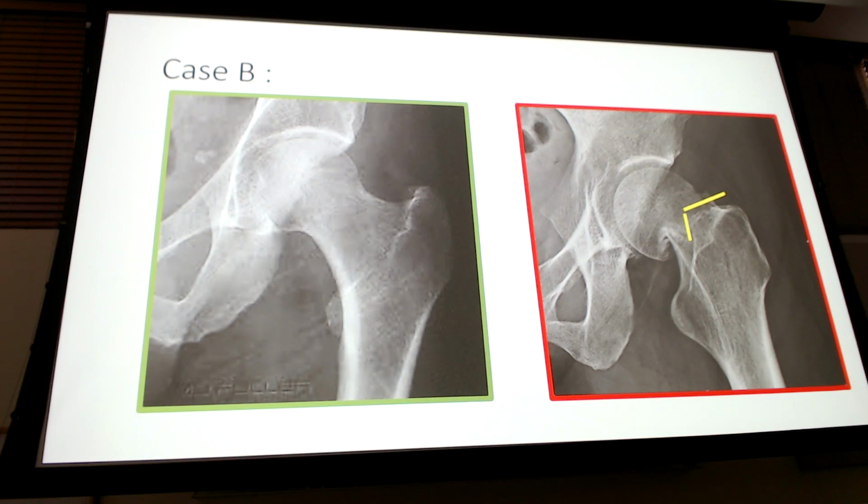Yes? Just to clarify. Yeah. This frog leg is a pediatric? No, the frog leg is basically a descriptor of the lateral hip x-ray. It's not just for pediatrics. When would you like me to get that order? You don't have to. You just need to order the hip, and you would order bilateral hips, and that's what you would get.